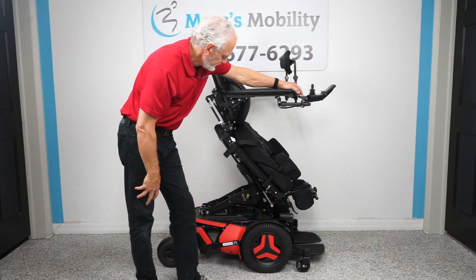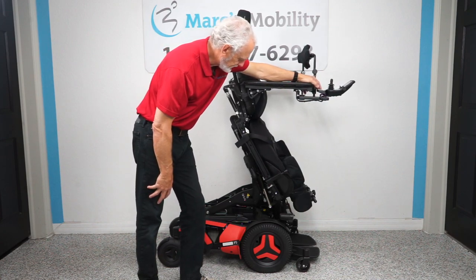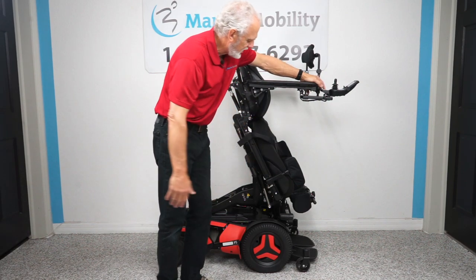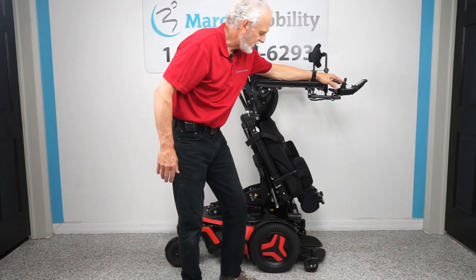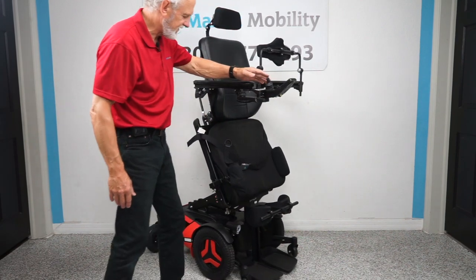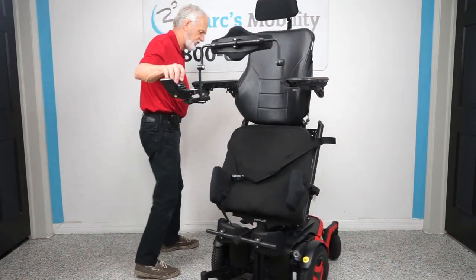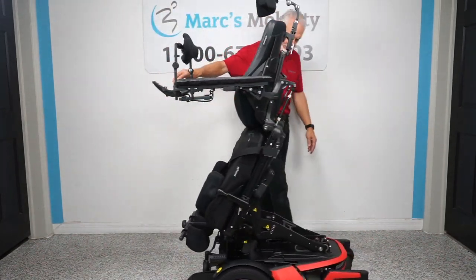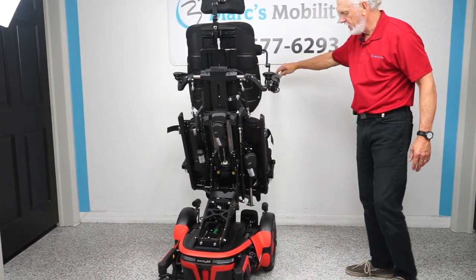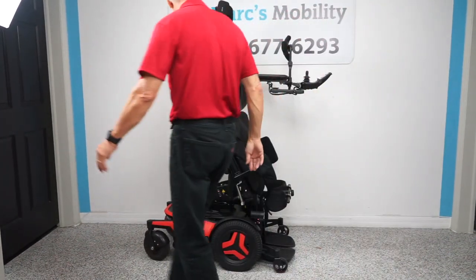We're almost all the way up. This is as far as it'll go — it won't stand you straight up, it always keeps you on an angle. That's the standing feature. The chair still drives with the standing feature. I'm going to turn the chair around so you can see the front. This is what it looks like from the front, and you can see how clean this chair is with only 27 miles — literally brand new.